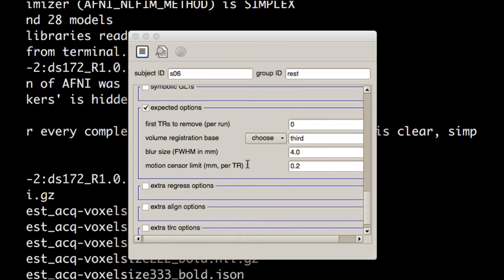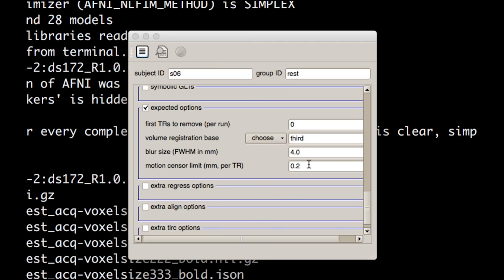Most of these defaults are fine. If you have any reason you want to change something like the smoothing or the volume registration base, go ahead and do so. But for these purposes, it's usually fine to just leave the defaults as is. Notice that the motion censor limit in a resting state analysis is much more stringent than in a task-related analysis. That's because motion usually has much greater effects in inducing either correlations or anti-correlations between different voxels in the brain. So for right now, we're going to leave that as a censor limit of 0.2 millimeters per TR.